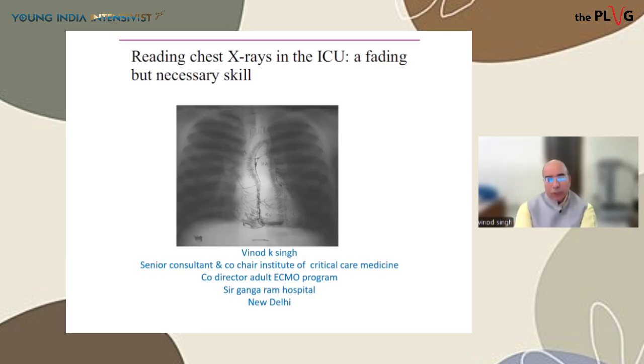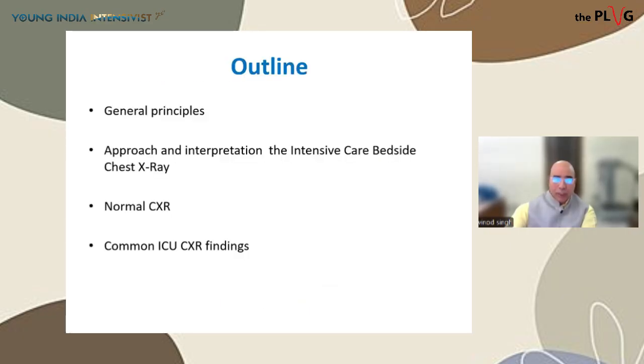So what I'm going to talk about is the chest X-ray. My talk is limited to the chest X-ray related to the intensive care unit, because it is a very vast subject and we will talk only about the relevant part of the chest X-ray which is used day to day in the ICU. I'm going to talk about certain general principles, how to approach. We'll consider some normal X-rays and some common X-ray findings.